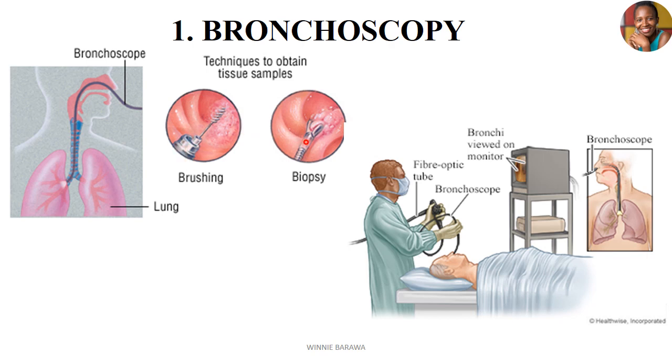We also can have a biopsy clip where you want to take a sample as you're going in to check the airways. You can clip and remove a biopsy for different purposes. So the bronchoscope has various features that can be used as you're going in. And remember, this is a live view. So as you're going in, you can see all these things at the same time and take all those samples if you wish to.